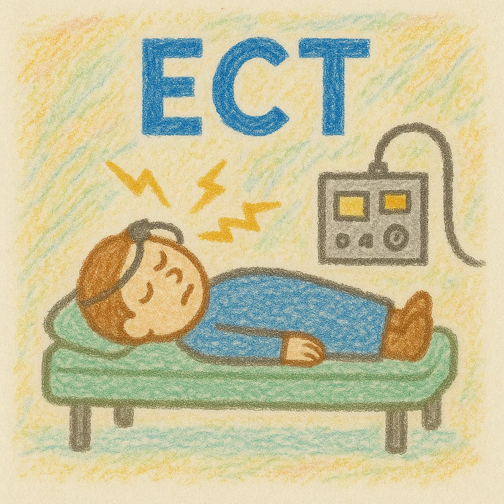And usually we're judging this by the motor seizure length, not the EEG seizure length. The motor manifestations of the seizure generally last shorter. They're always going to be shorter than the EEG manifestations of the seizure. So you might get a 10-second length of convulsions with the right ankle, but the EEG manifestations of the seizure might go on for 30 seconds. But if you're only getting 10 seconds of convulsions, then you still might do something.